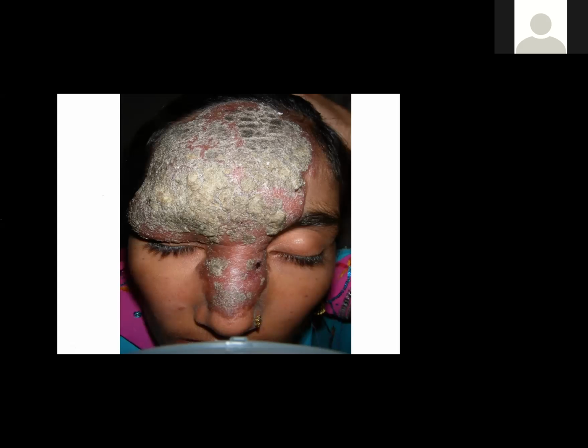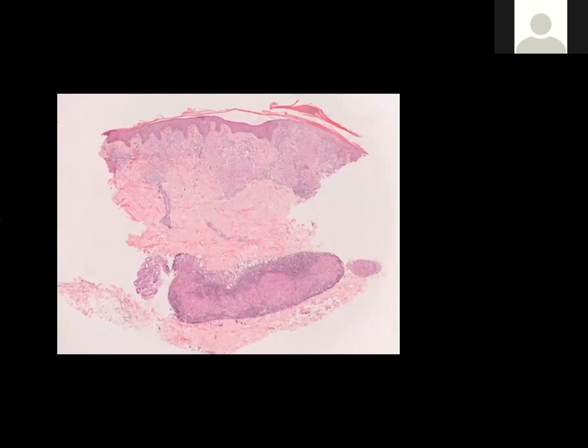And when we take a biopsy from a tuberculoid leprosy, even at a lower magnification, we can easily make a diagnosis of leprosy by what we refer to as the characteristic leprosy pattern. Now, when we see a pattern showing superficial and deep, oval, oblong, and curvy linear, well circumscribed infiltrates of epithelioid cell granulomas in perivascular, periappendageal, and perineural locations, we are sure that we are dealing with a leprosy pattern, and these granulomas are suggestive of tuberculoid leprosy.